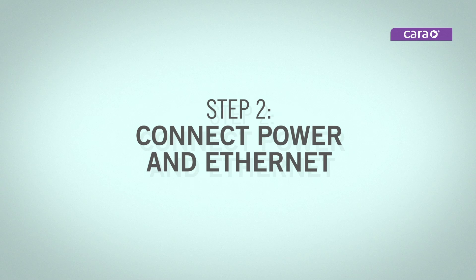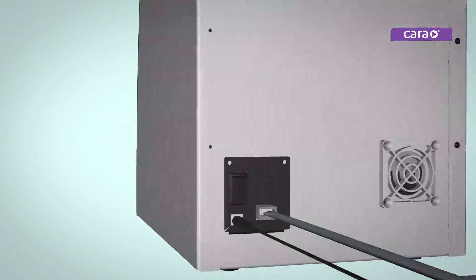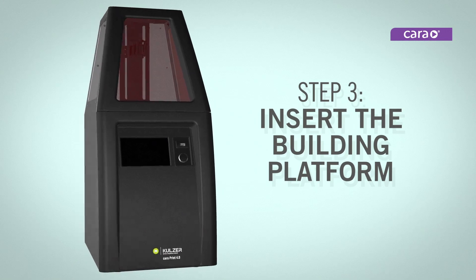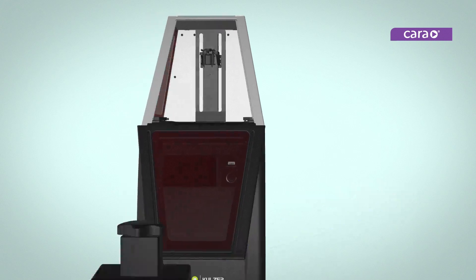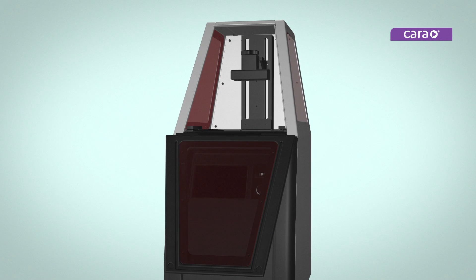Connect the power cable and ethernet cable and flip the main power switch on the back. Open CaraPrint 4.0 using the handle at the top of the front window. Loosen the nut of the Z-axis building platform, insert it at the top of the printer, and tighten.